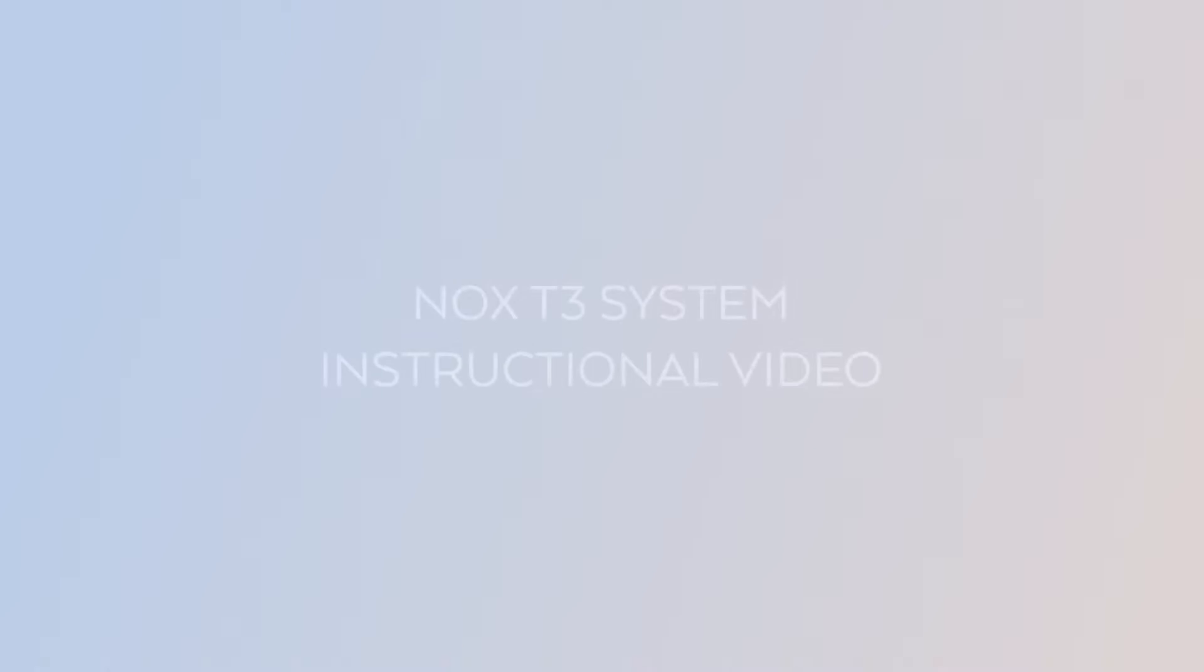This video is intended as a guide on how to set up the Nox T3 sleep monitor. You can pause, stop, and replay at any time to see specific instructions more clearly.